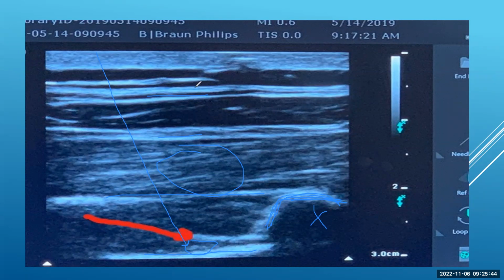So we're not here to discuss that particular block in detail, but it does really highlight one. You can see the bone, you can see these fascial planes, you can see another hypoechoic structure at the bottom. It's going to slide back and forth. That means the person's breathing and they don't have a pneumothorax. And so that lets us know that the sliding, that things are going well. And we can also see the anatomical area that is desired to puncture with our needle and deposit local anesthetic.